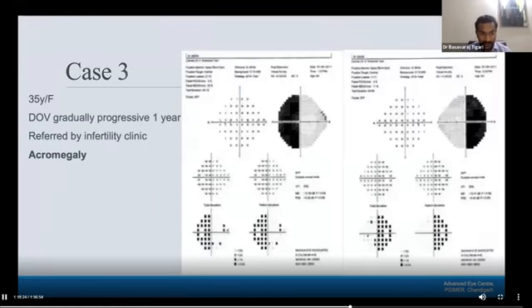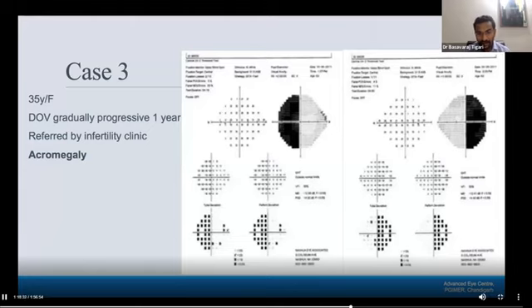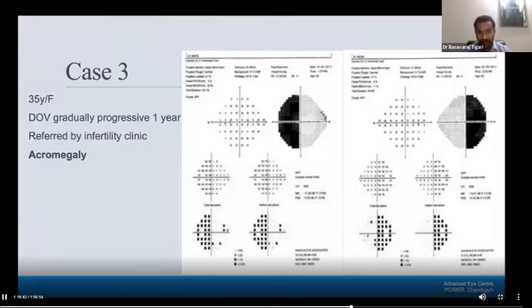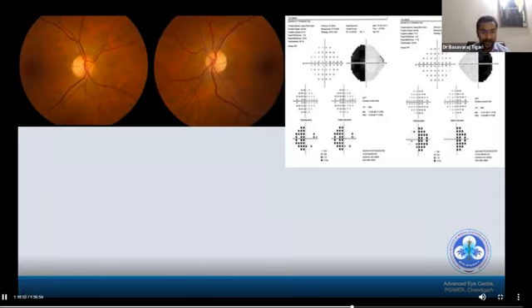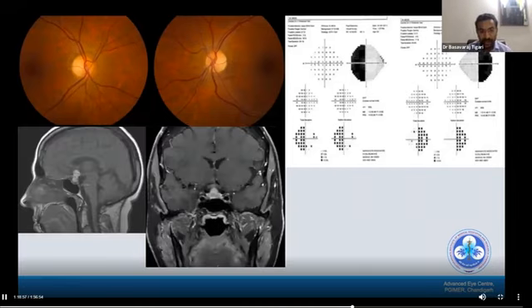Case three: a 35-year-old female with gradual progressive vision loss over the last year, referred by an infertility clinic for clearance for gonadotropin-releasing hormone therapy. Clinical examination showed acromegaly. The visual field showed bitemporal hemianopia, and fundus examination showed mild pallor of the optic disc. Neuroimaging was performed and revealed a pituitary adenoma.